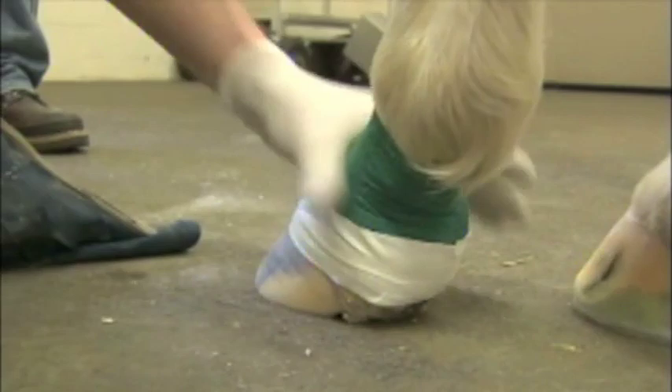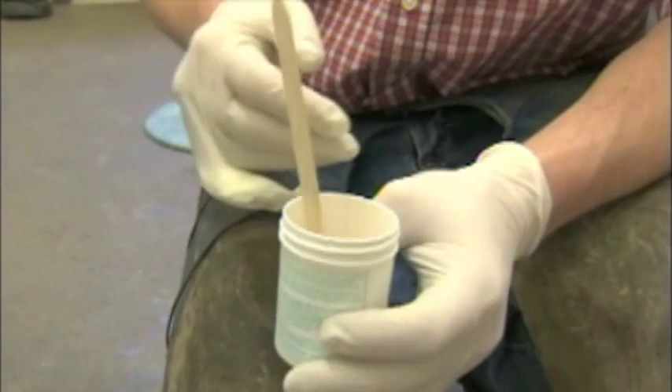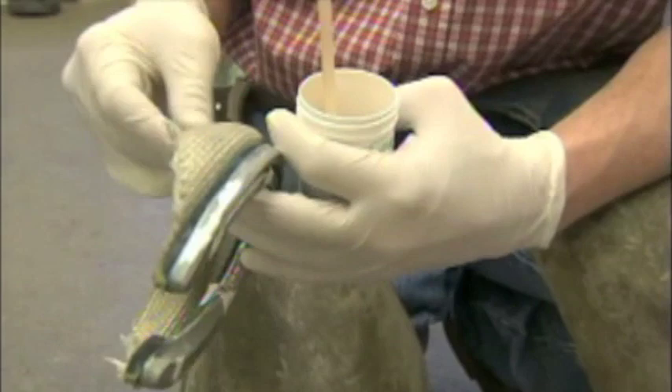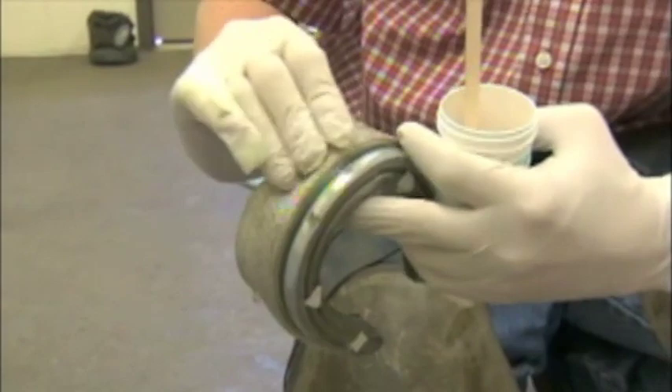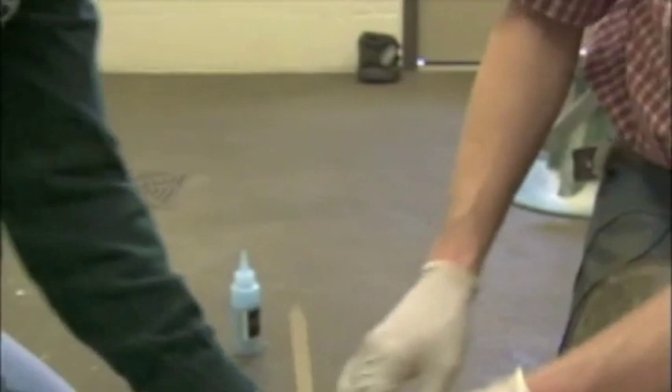That makes it a lot neater and nicer. Pull this tape off and you'll have no glue on the hairline. We're using a two-ounce jar of Equilox and we're not going to mix fiber in this one like we did on the last one. We're just going to use the Equilox straight, then she'll mix it up and we'll impregnate this fiberglass cuff with the glue - just smeared in there really good. I'll put some on the wall and then we'll wrap it on with some plastic wrap. So she'll mix up the glue here.